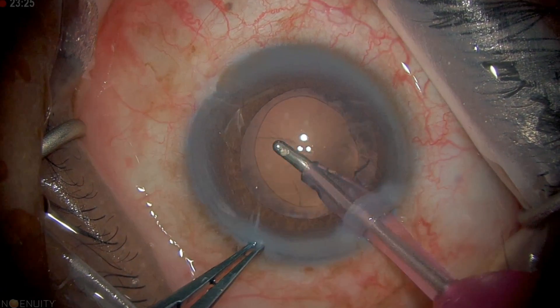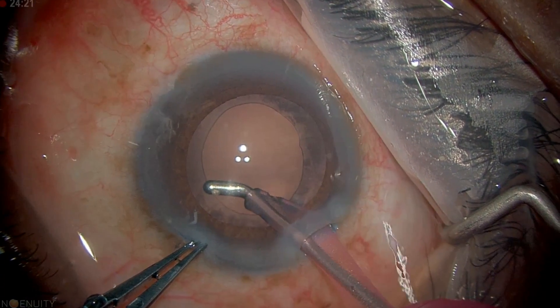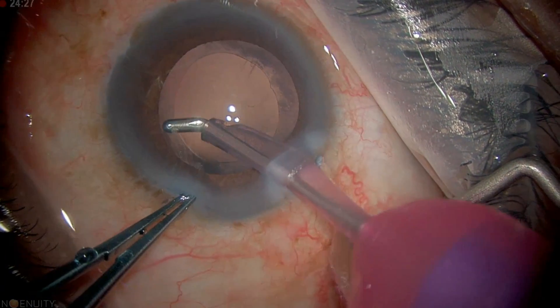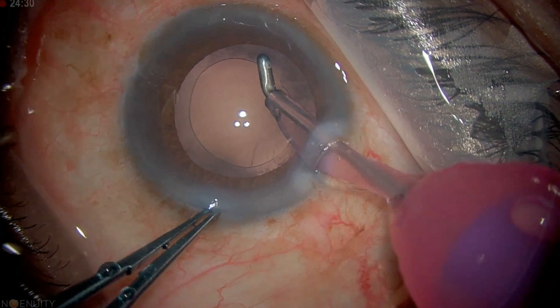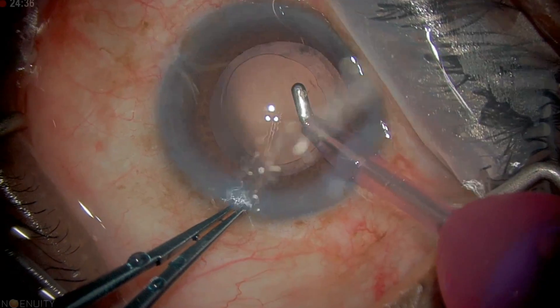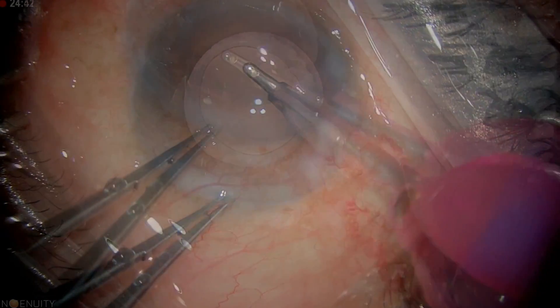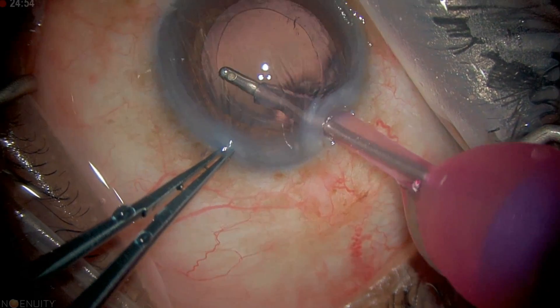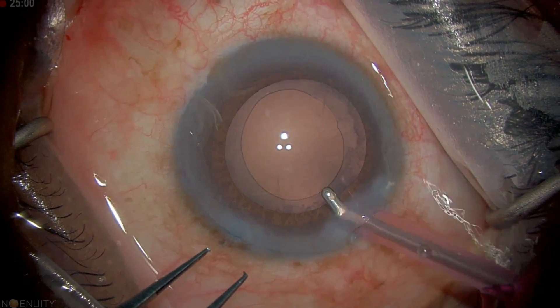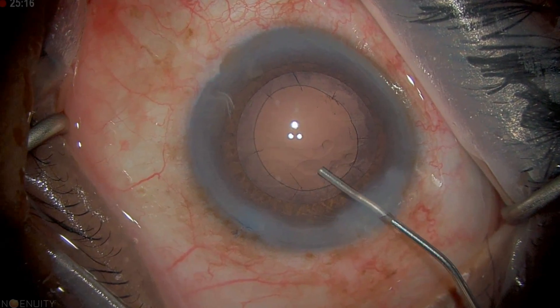It's a bit of a floppy bag, but it's going to be fine for this lens. As we discussed briefly this morning, we have some lens epithelial cells here; while they're important for forming the seal around the bag, they can sometimes lead to capsular phimosis. So I do a little lens epithelial cell cleanup with a polish technique — I'm at a vacuum of 50 and aspiration flow rate of 12, so low vac, low flow. It's quite a safe technique.